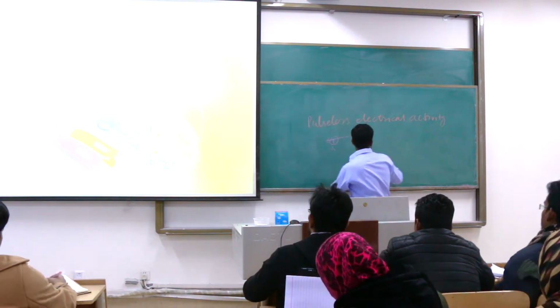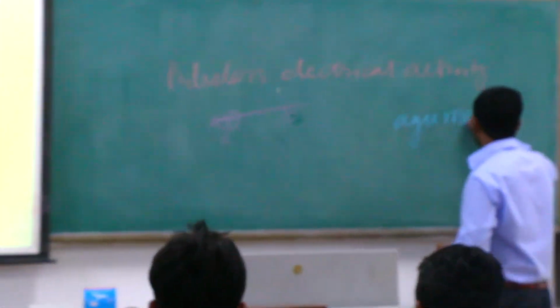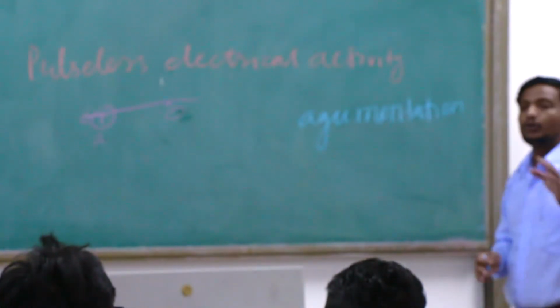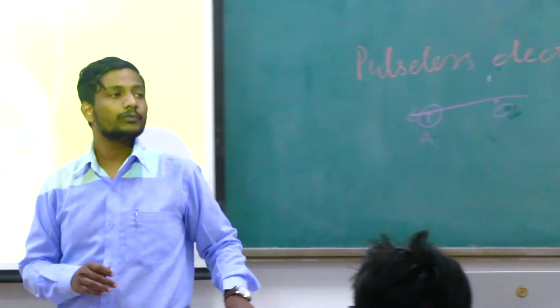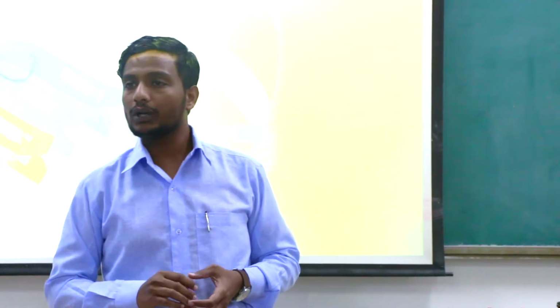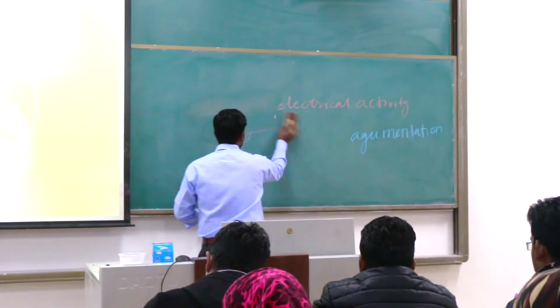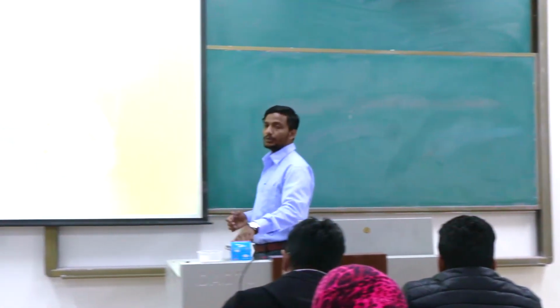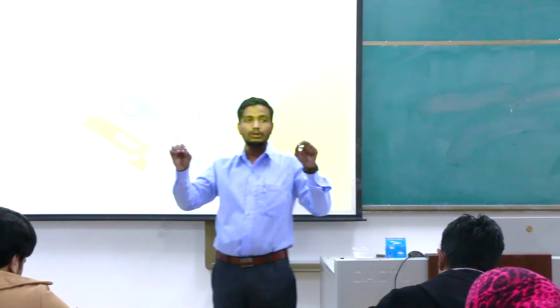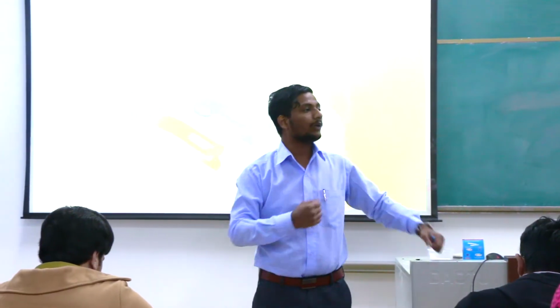It is simply called augmentation. What do we call it? Augmentation. It means the current we receive on our paper is augmented by this particular electrode. The neutral electrode is connected to the right foot, so on the right leg we use the neutral one, and its job is to augment the current. Right? Okay, now these 10 electrodes give rise to altogether 12 leads. A lead is the recording by the electrodes of the current resulting from our heart activity.